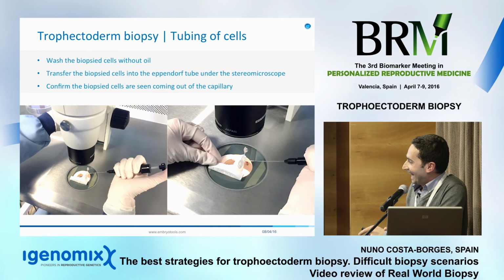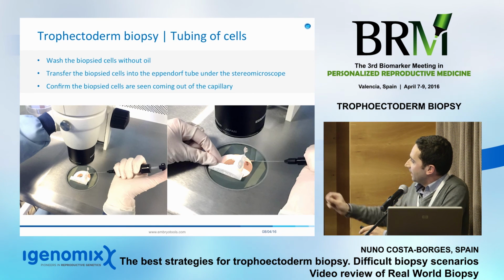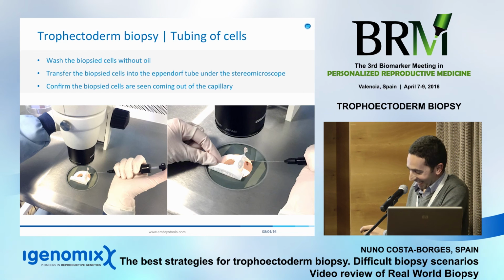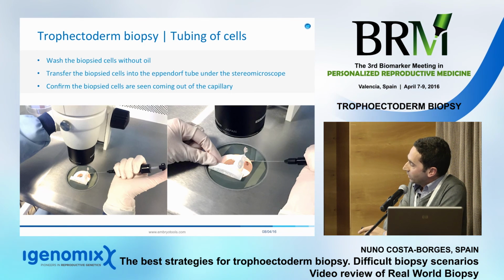What do you think? In our protocol, we cover with the... You cover it all, but do you wash? Yes, yes, because in some labs I know they just take them from the droplet where they biopsy and directly put them inside, and I think it's because they're afraid of losing the cells. But okay, so ideally we should wash them.